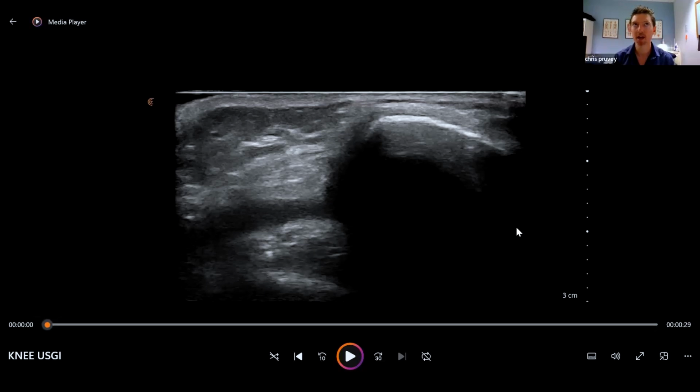I think everyone who's had this experience has said, having seen how difficult it is to get a needle, and I'm not trying to big up ultrasound guided, it's incredibly difficult to get in some of the target, and I would say it's impossible that you're in the target tissue in some of the landmark guided injections.